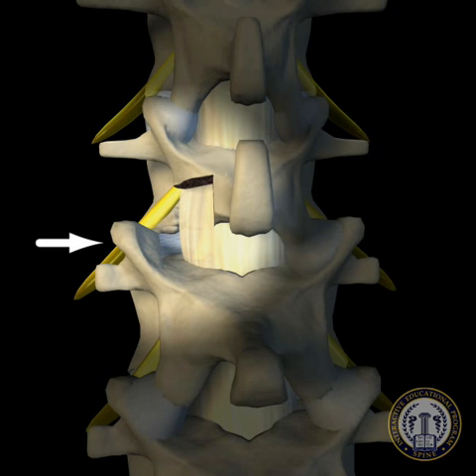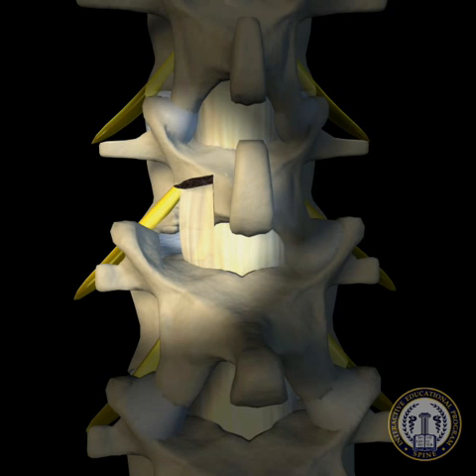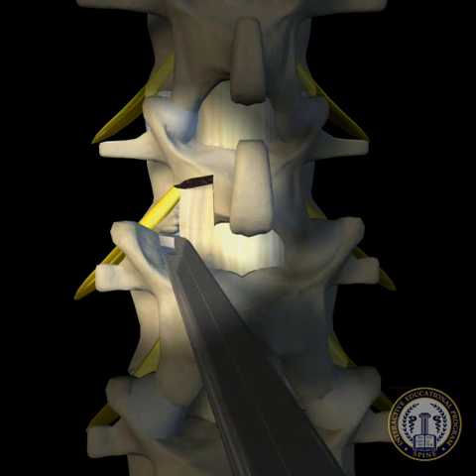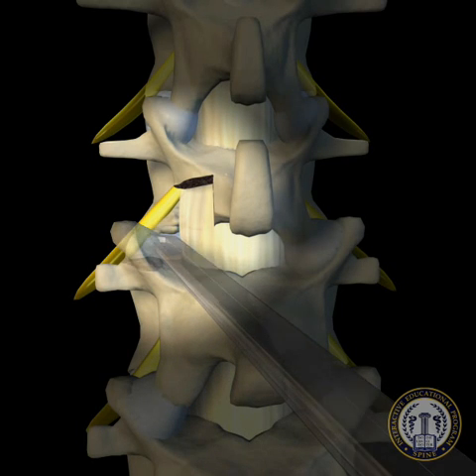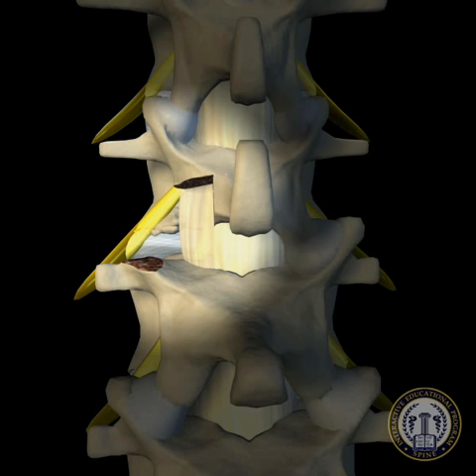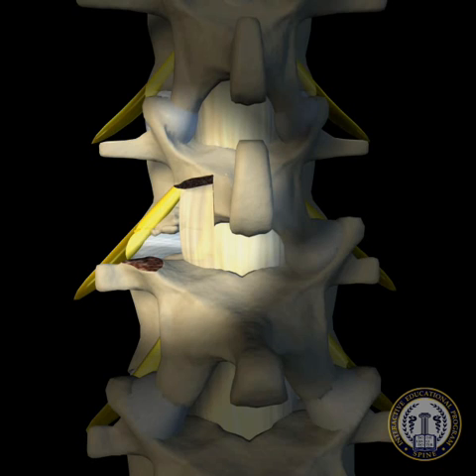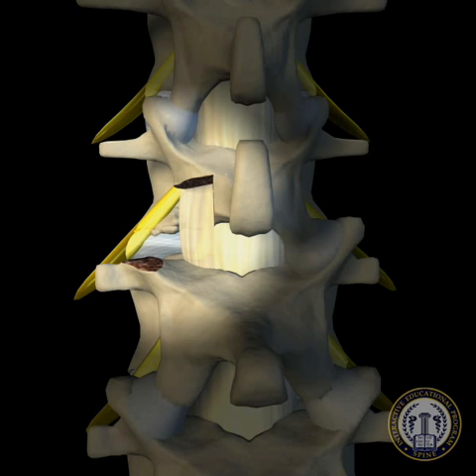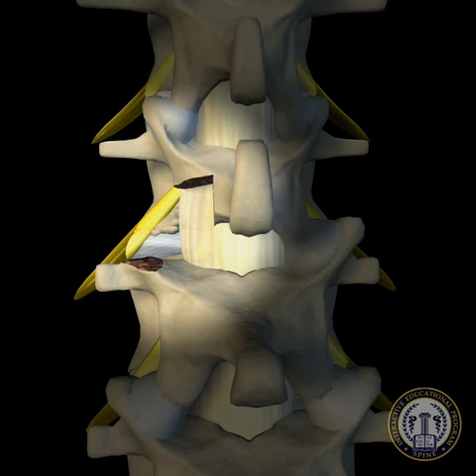The remaining superior facet is then partially drilled and removed in a stepwise fashion using a Kerrison rongeur. When using a high-speed drill, care must be taken to avoid breaching the inferior pedicle. All bone removed is morselized and saved for use as graft material later in the case. A ligamentum flavum covering is left intact to protect the dura mater and nerve roots during the facetectomy.